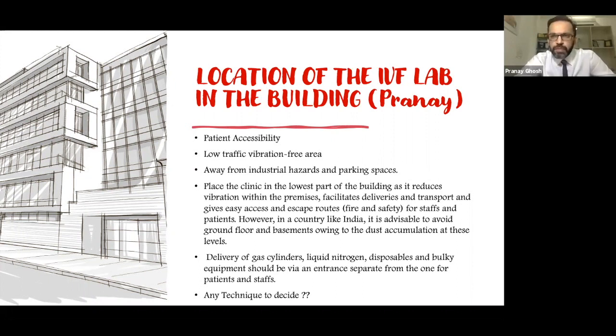If possible, I would also not want the lab to share walls with another unit whose activities you cannot control, so that you are in control of the vibration levels and the VOC levels of your lab.